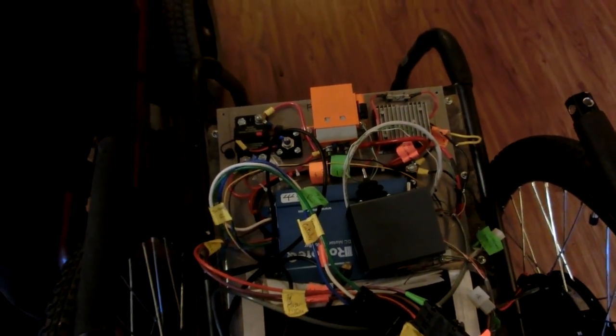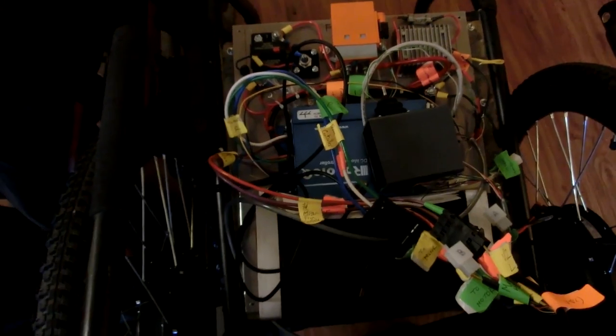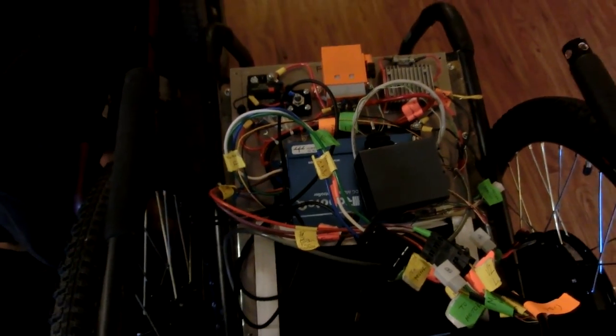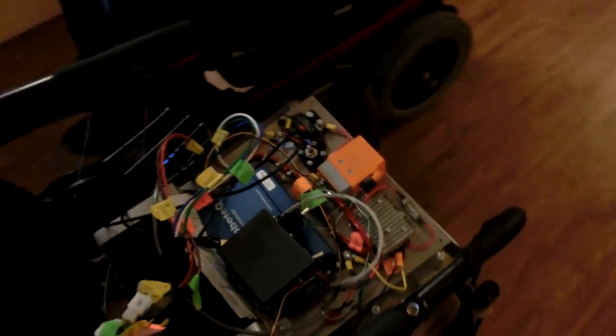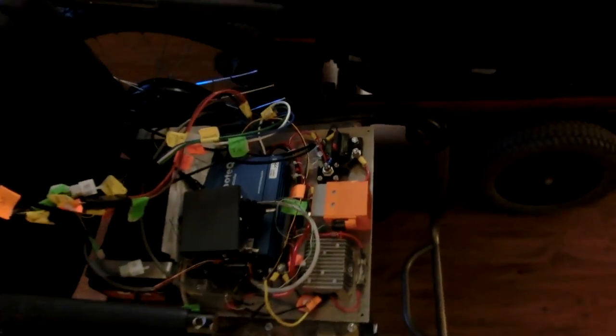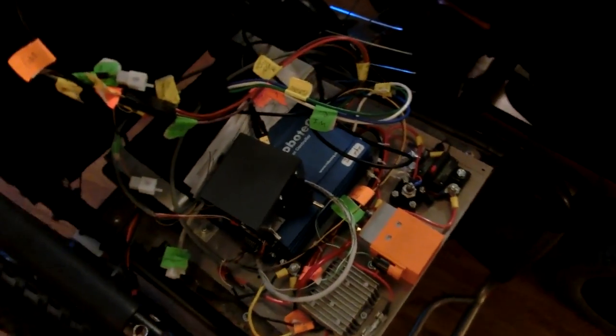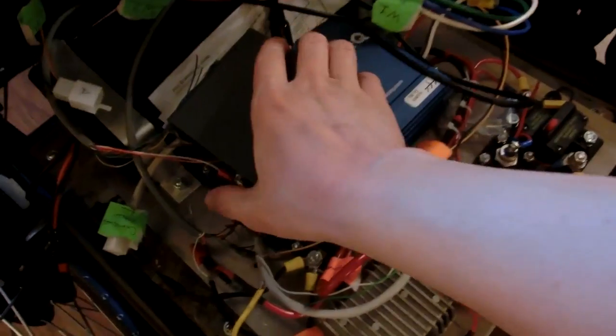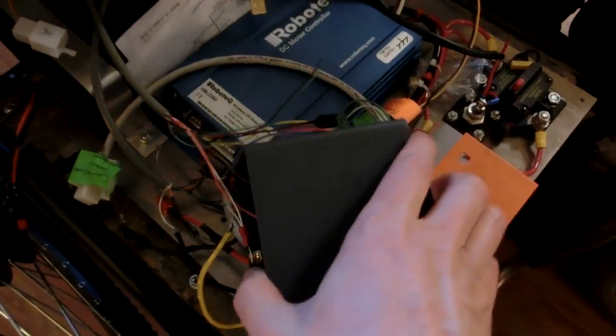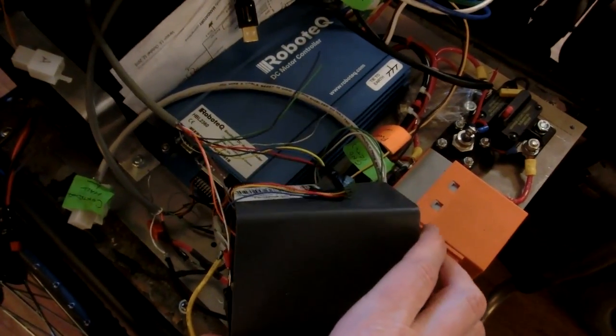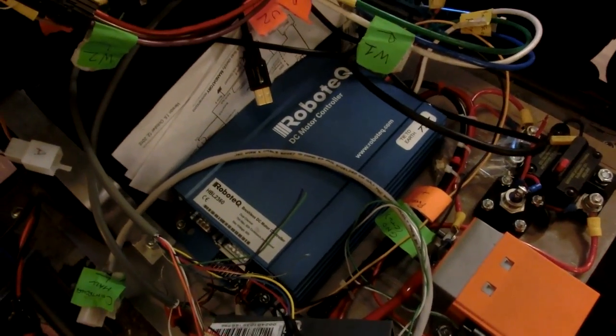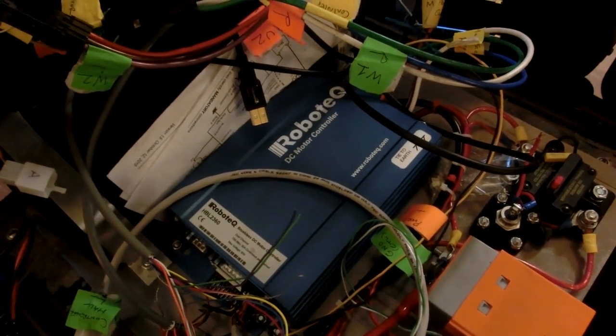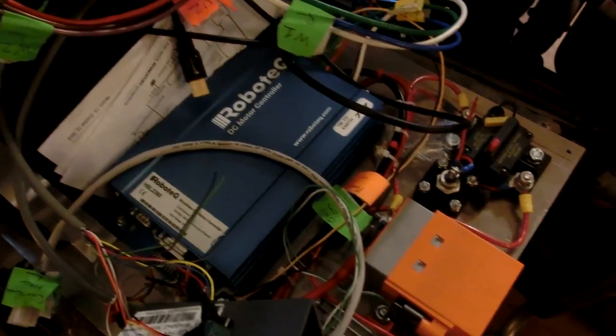What we're doing now is we're going to run a contactor that can handle the continuous current of it and it's ready to roll. Already tested it and everything.